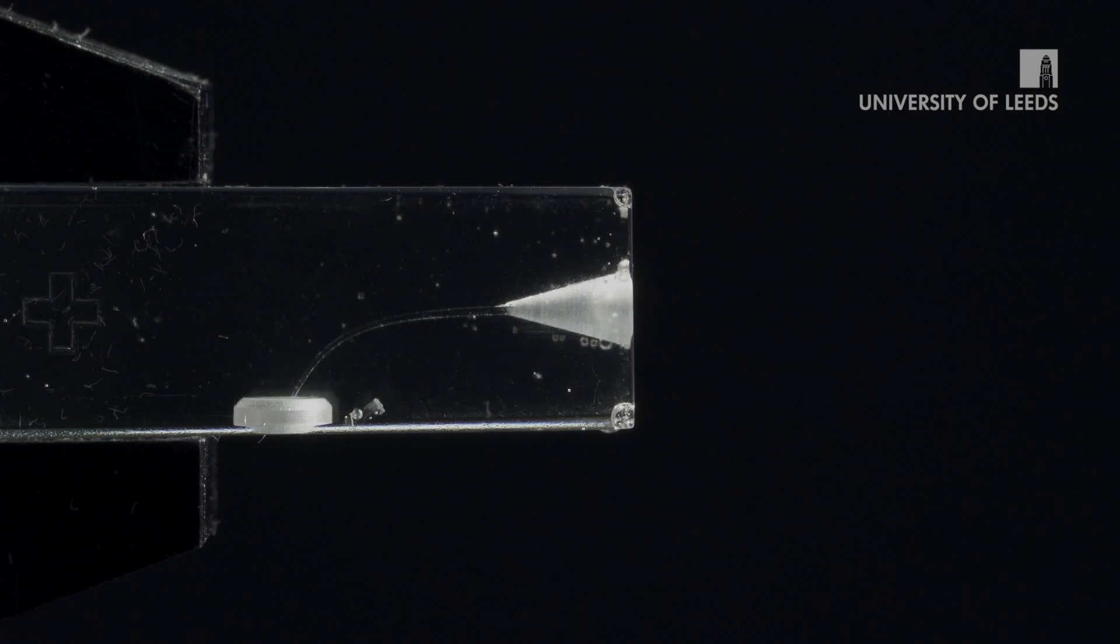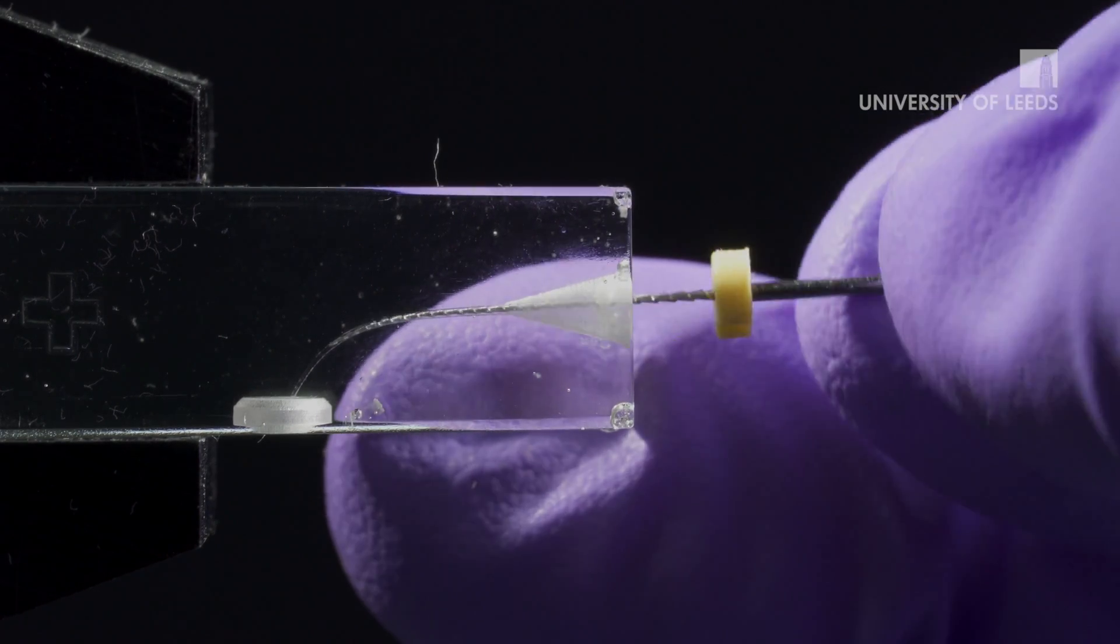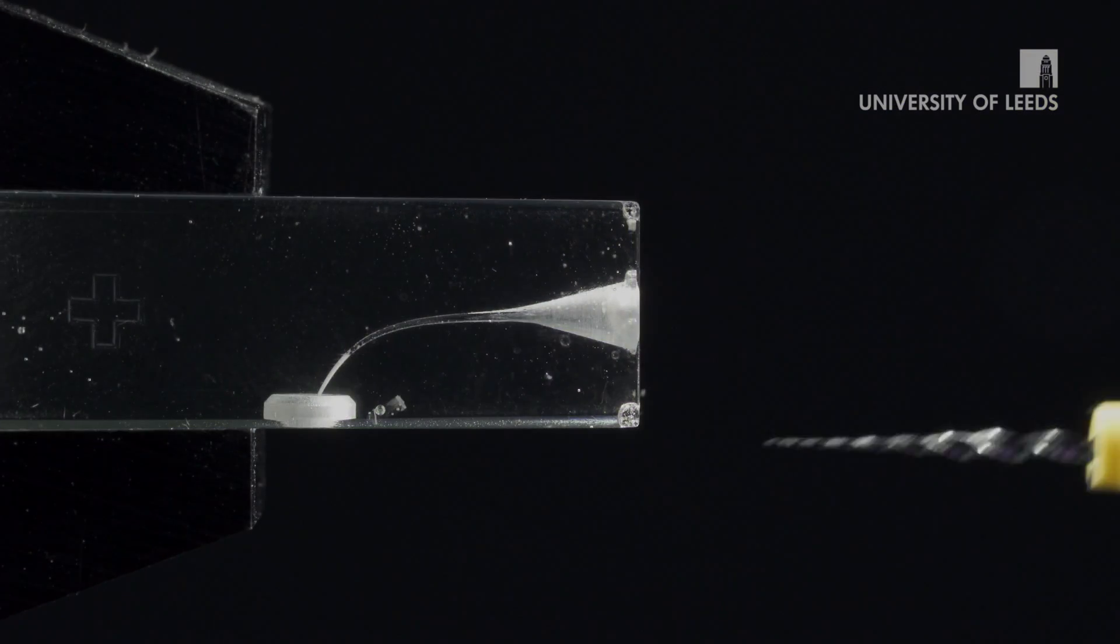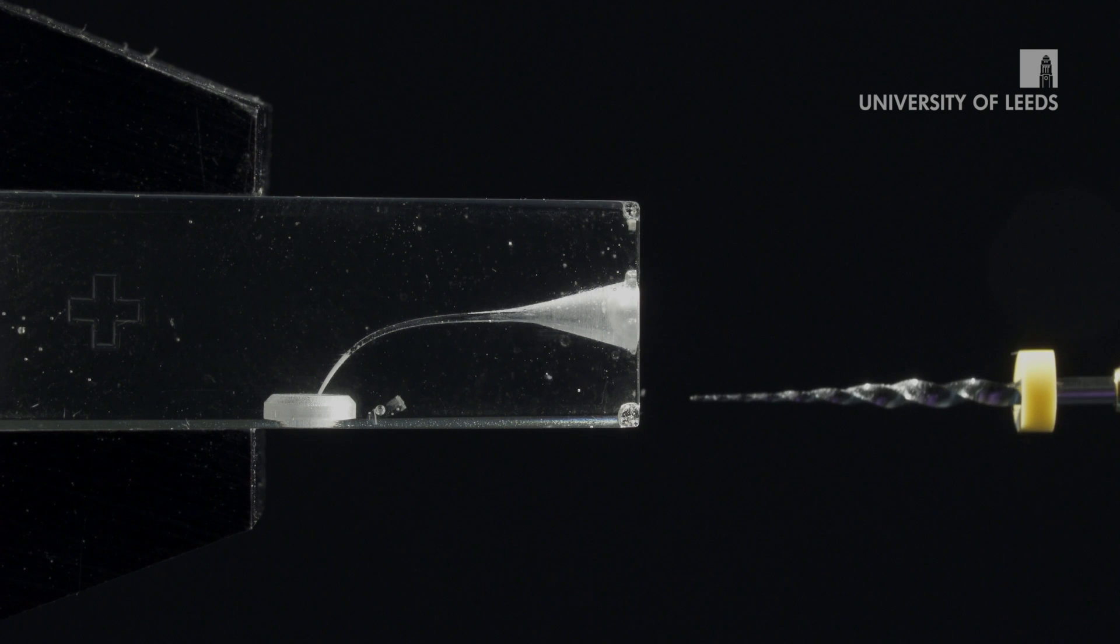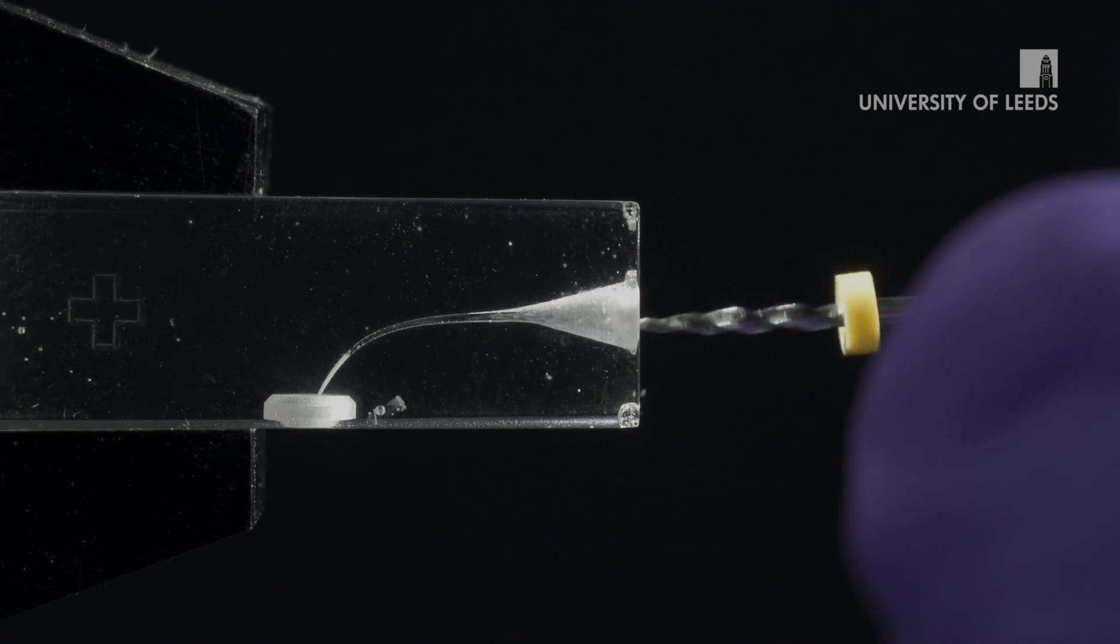After each file is used, the canal should be irrigated. Having secured the coronal glide path, the rotary SX file is now used. This file has a 0.19 millimeter tip and variable taper along its length.